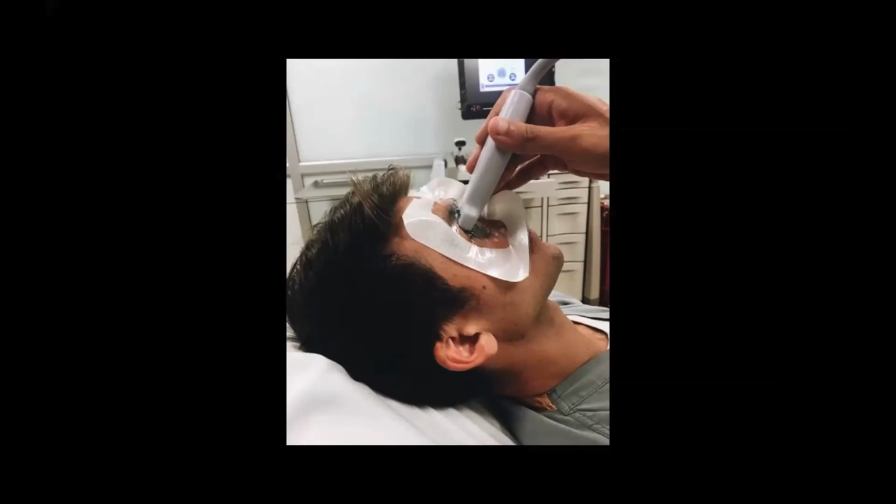Gel can cause a minor amount of irritation, and so it may be more comfortable for the patient to do that. The counter to that would be, it's really hard to get a Tegaderm on the eye and get all the air out from underneath it. There's always a little bit of air in the medial and lateral canthus, despite your best efforts. And so that air is going to cause a little bit of reverberation artifact and obscure some of the image that you're looking at. So it's harder to get as clean and crisp and clear of an image.